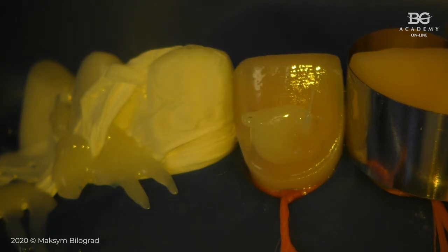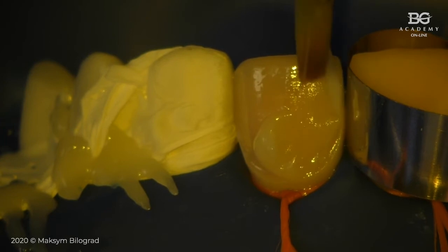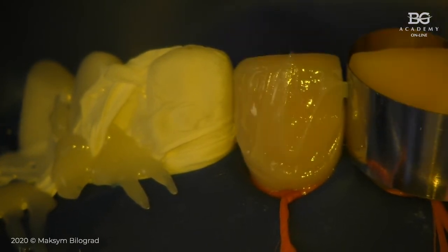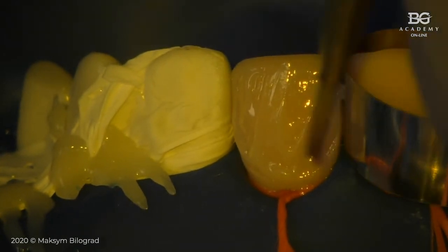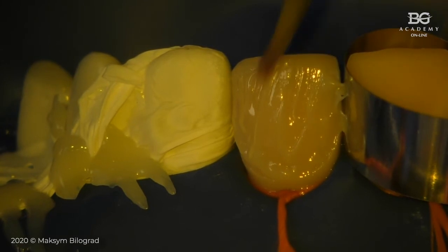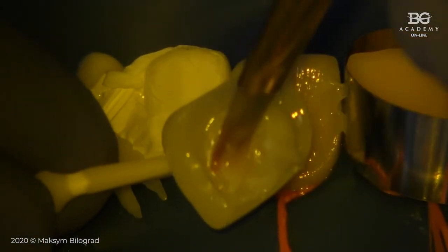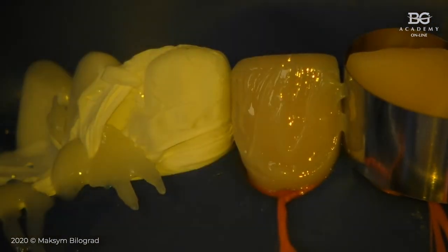Then I'm taking a dry brush and spreading this layer of cement all over the tooth, especially in the area of the finish lines. Same, I have to control that I have enough cement in the area of the veneer. Okay, great. And then I will put my veneer on the tooth like this.